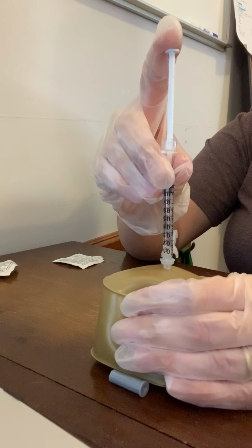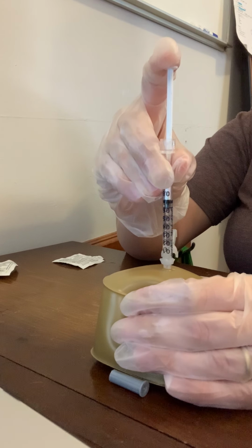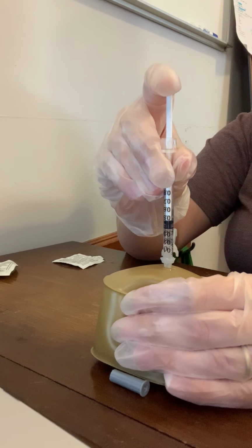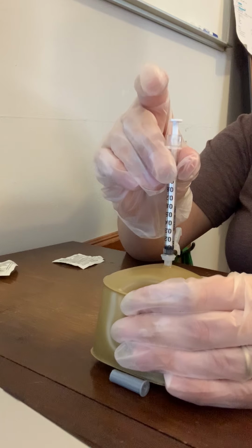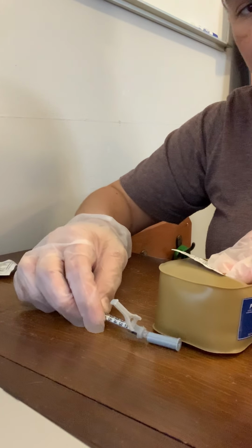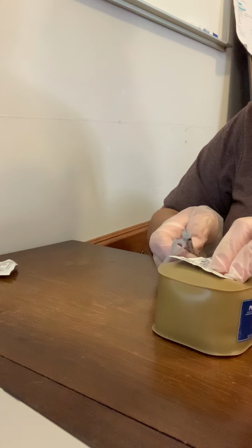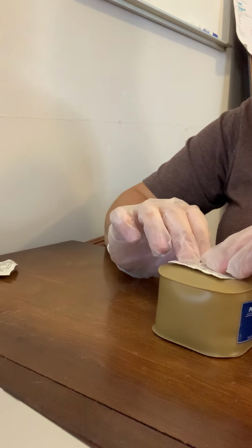Stabilize my syringe. And I'm going to inject slowly. And leave the needle for about 5 seconds. I'll apply my gauze, and then I'm going to discard my needle into the sharps container, applying gentle pressure with my gauze.